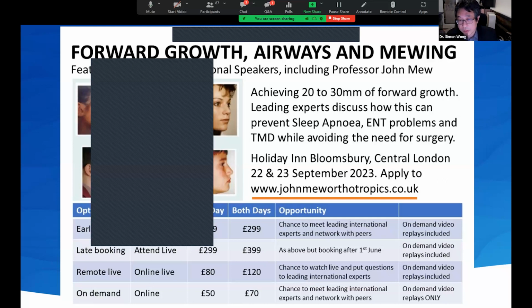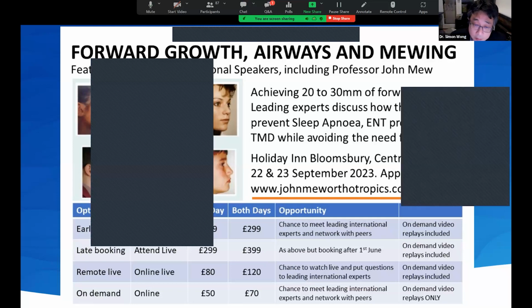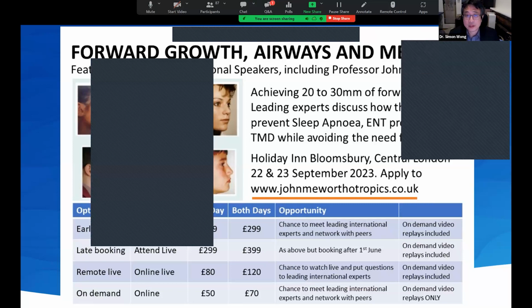Yes, if you use a stage 3 appliance, which is the single most important apparatus created for orthodontics by John Mew. But it has a very different mechanism. When you use a screw to turn acrylic to apply pressure on the dental alveolar bone, that's a mechanism that works in pre-pubertal children. But once you hit puberty, the bone hardens and you can't continue to use mechanics.